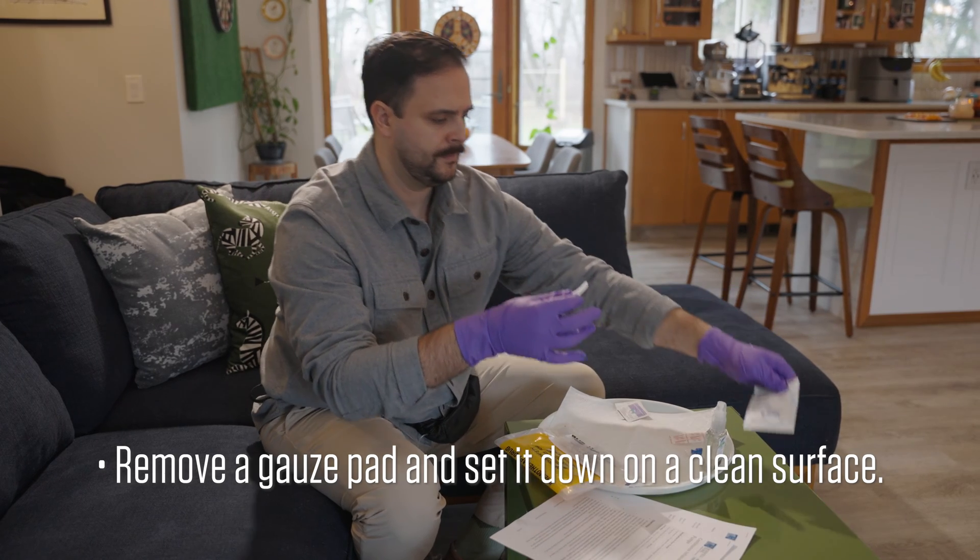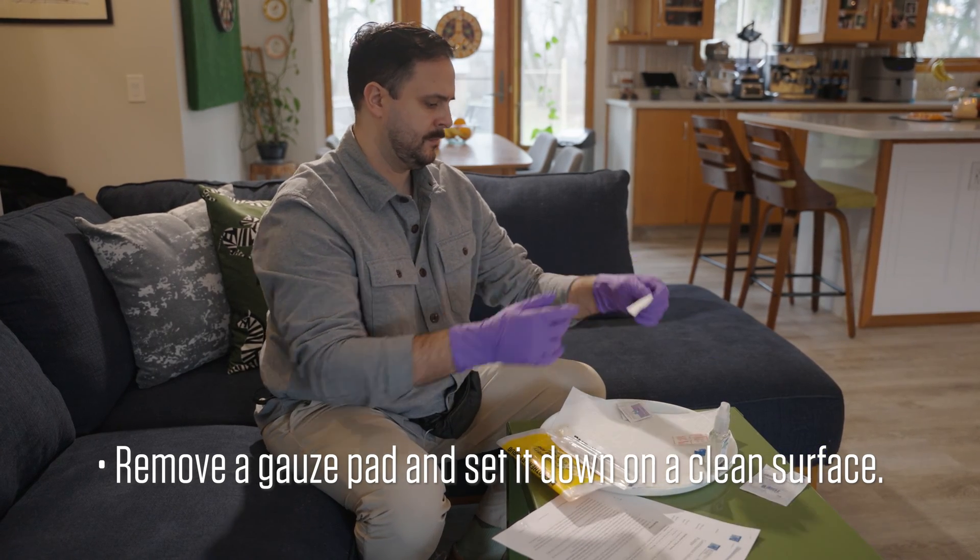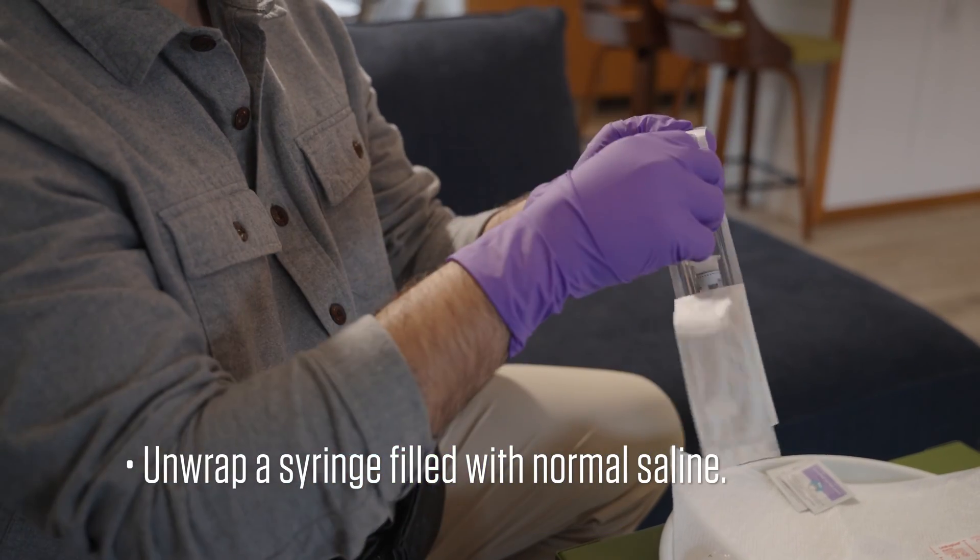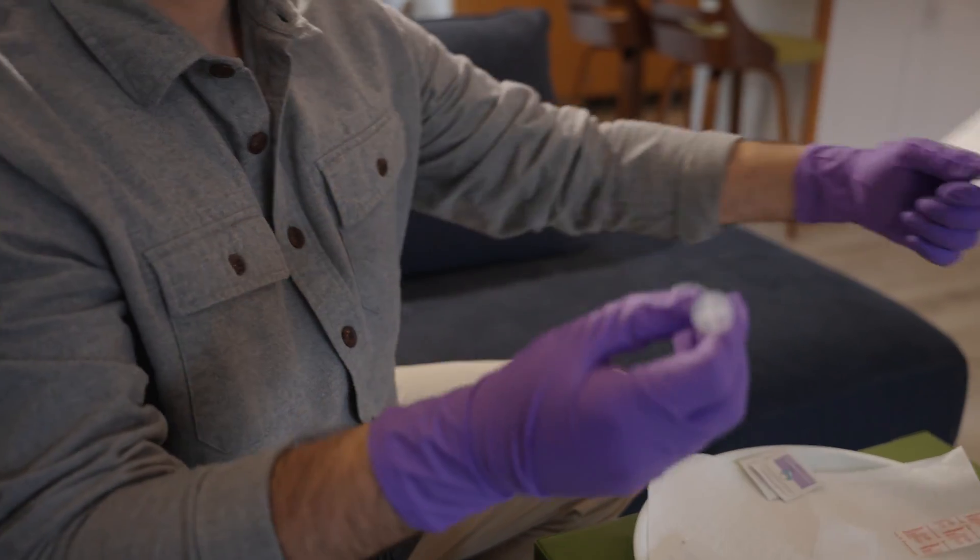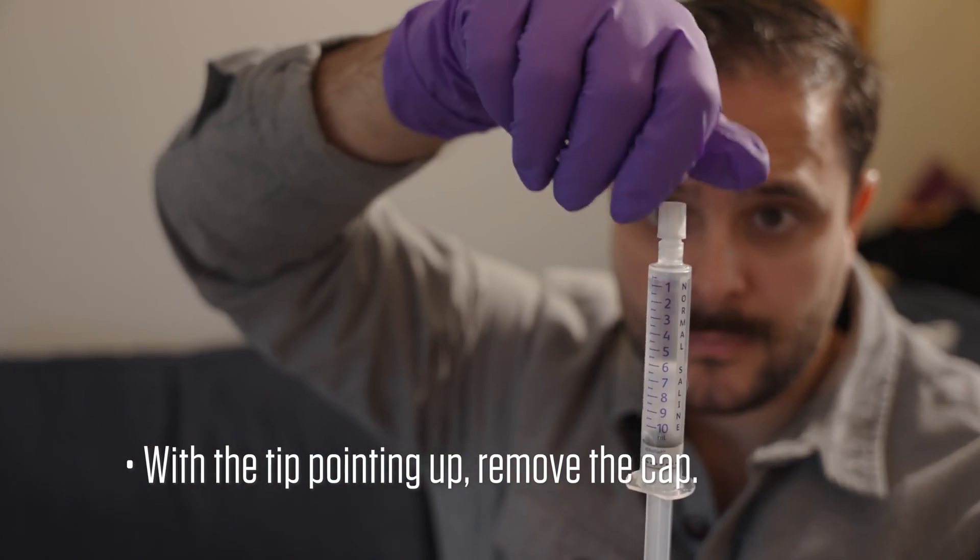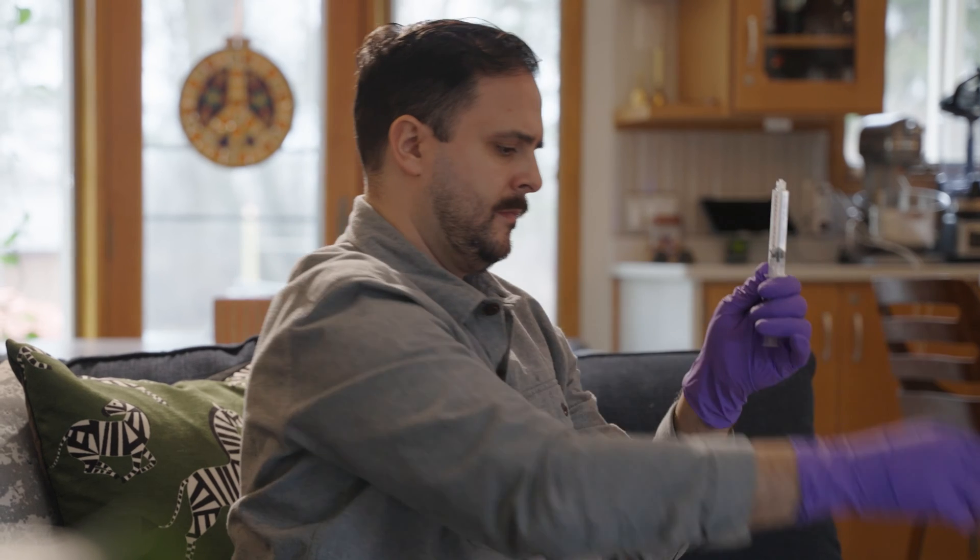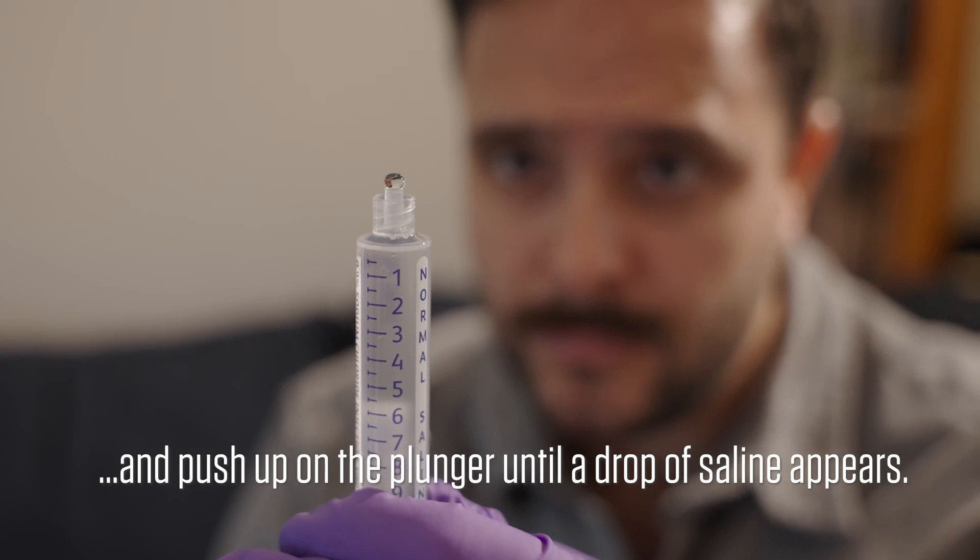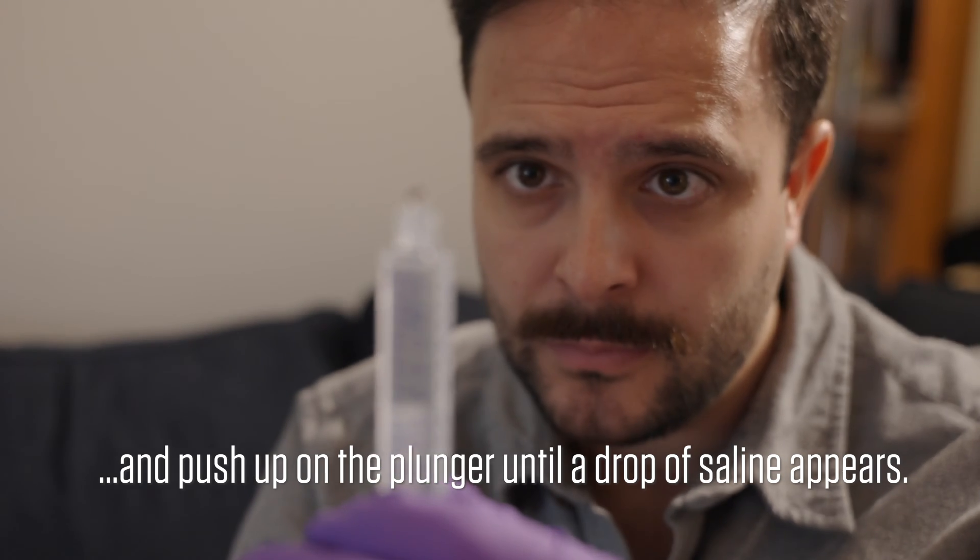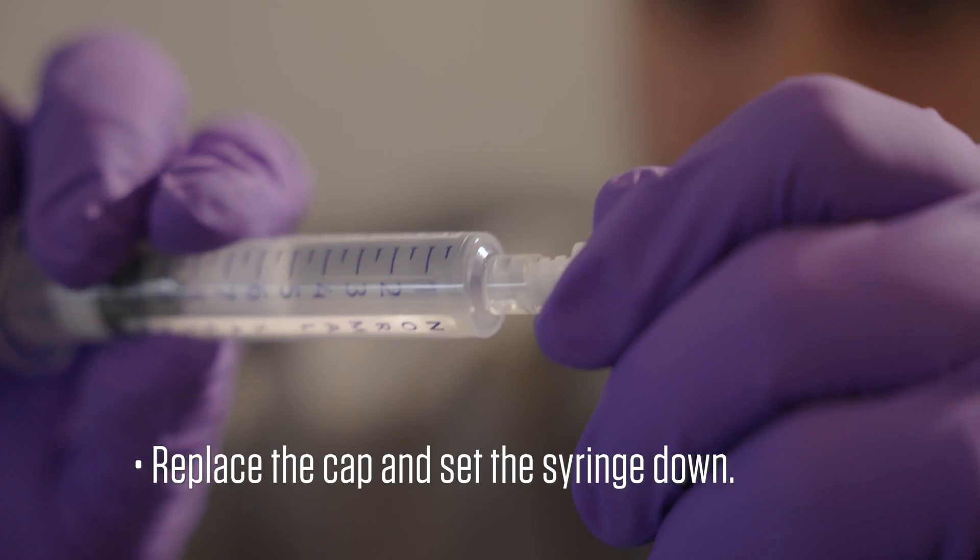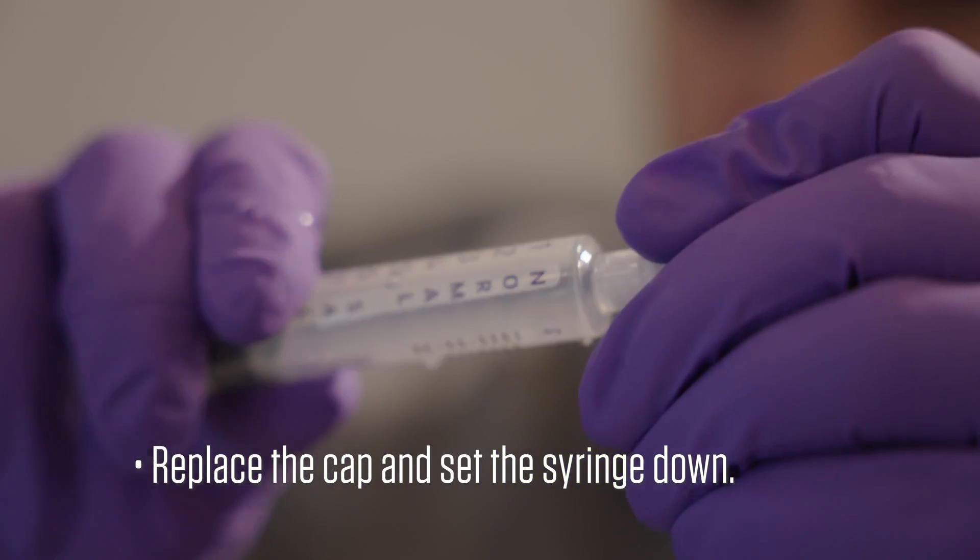Remove a gauze pad and set it down on a clean surface. Unwrap a syringe filled with normal saline. With the tip pointing up, remove the cap and push up on the plunger until a drop of saline appears. Replace the cap and set the syringe down.